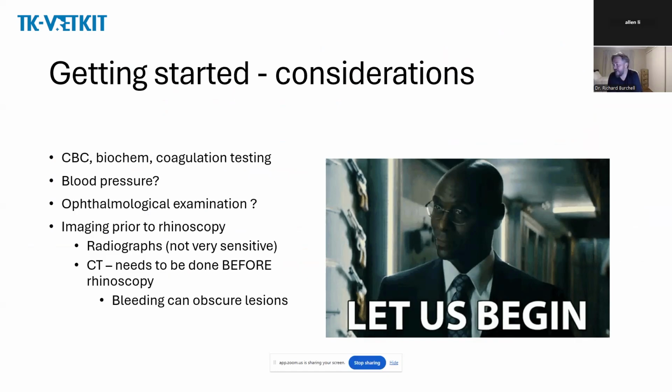What are some of the things that we need to consider, or what is some of the preparation we need to do prior to doing rhinoscopy? Well, depending on where in the world you might be listening to this from, increasingly we come under pressure from a cost perspective to ensure that everything that we do is financially justified.